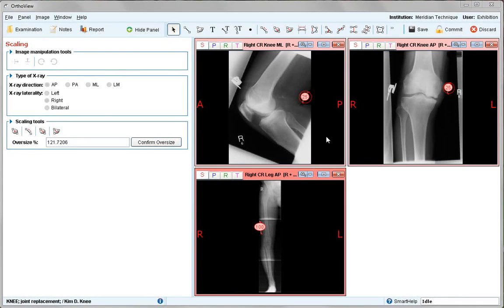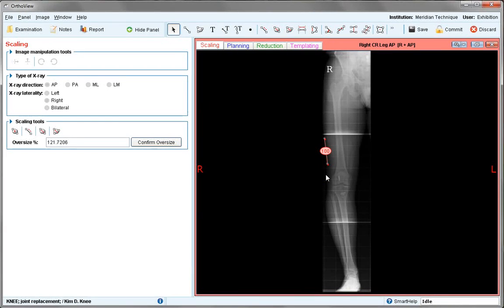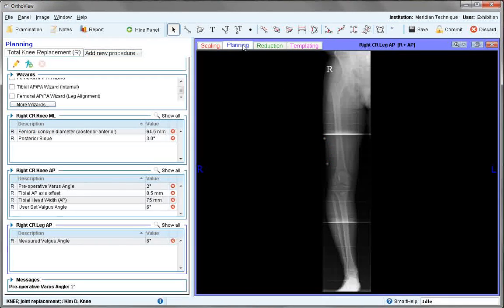The knee joint images have been scaled using the quick scale marker by just clicking on the object, remembering to check the direction for the lateral view. The long leg image has been scaled using the line tool and overtyping the size required. All images will automatically be moved to planning once scaling is completed.